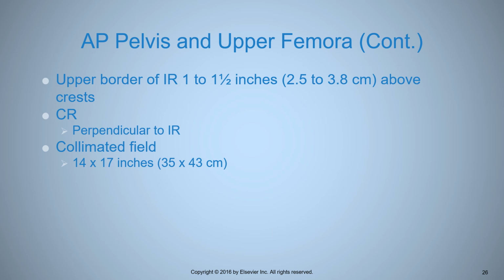And so if you're using a gridded cassette in a trauma situation, make sure the grid is horizontal at the time you shoot, or you should cant your X-ray to make sure that your X-ray beam is intersecting your grid at a perpendicular. So if you get it under there, but the grid is kind of slanted and not in a true horizontal plane, you'll end up with grid cutoff unless your X-ray beam is also slanted to match, so it's intersecting your image receptor at a true perpendicular.